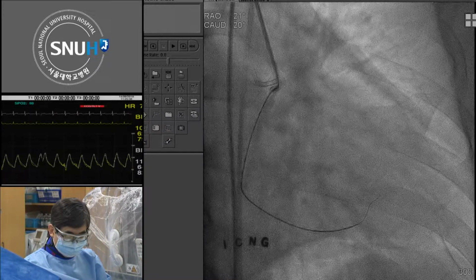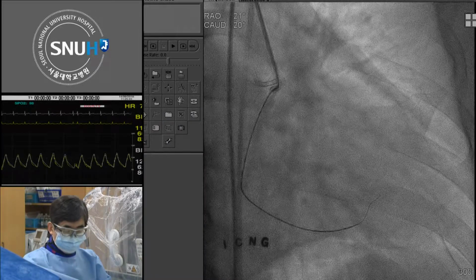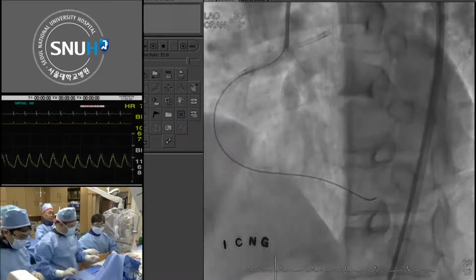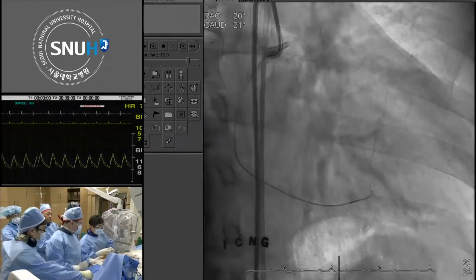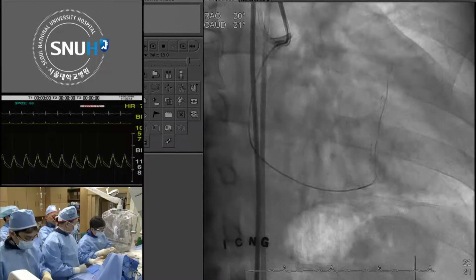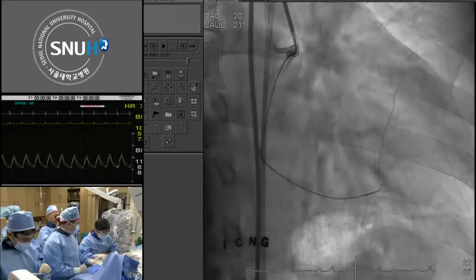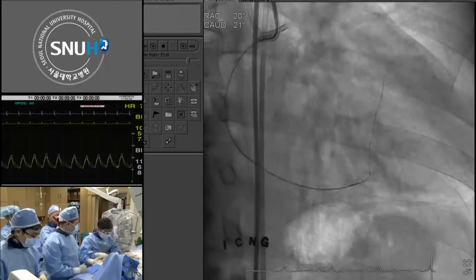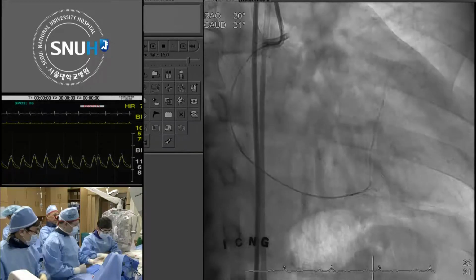We've talked about this band in the beginning when we saw it. Yes. But I truly didn't realize that it would be that difficult. Pre-shaped? Yeah, already pre-shaped. I like it.